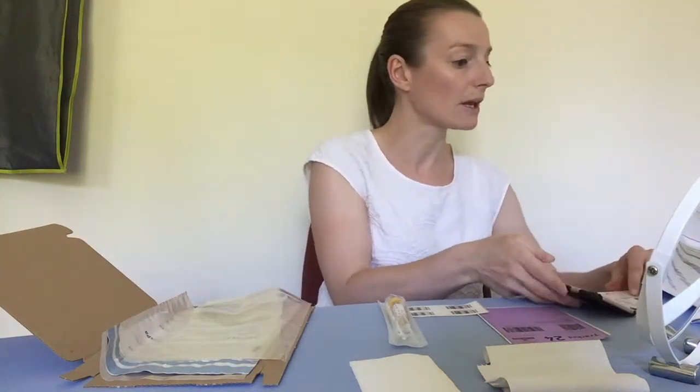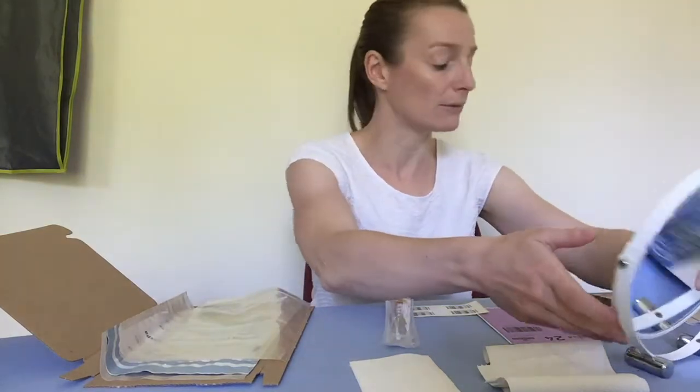The next thing you have to do is wash your hands really carefully — 20 seconds with soap and water. Then put all of the things from the test kit on a surface, and I'd suggest somewhere where you've got a good mirror, because that's going to be quite helpful.